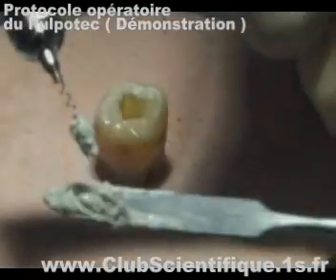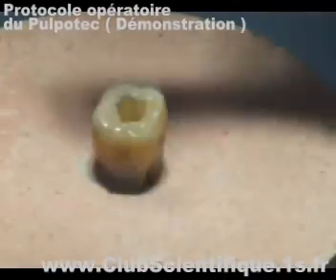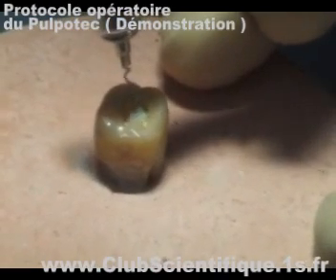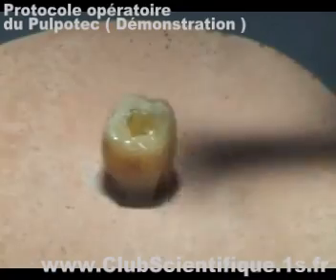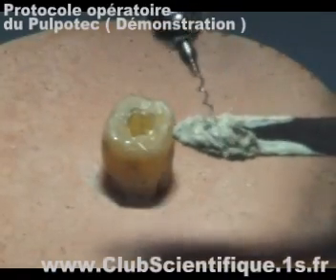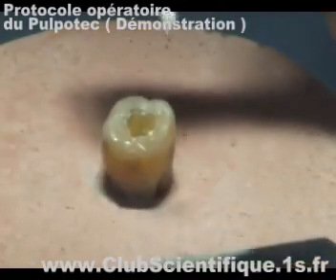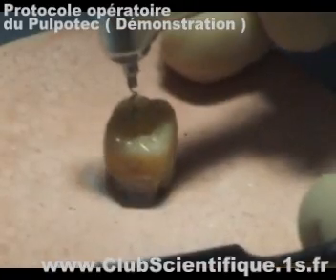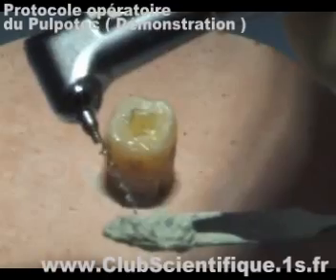Use a large diameter rotary paste filler to place Pulpatec inside the pulp chamber. Make sure all the available space is tightly filled.